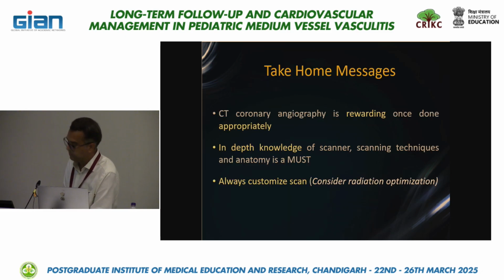So the take-home messages are that CT angiography is rewarding once it is done appropriately, and in-depth knowledge of scanning technique and anatomy is important. And always customize your scan with proper radiation optimization to have the least radiation, optimal CT imaging. Thank you.